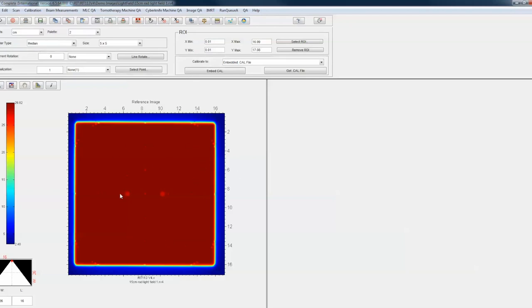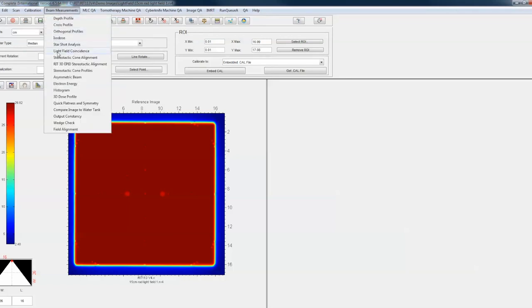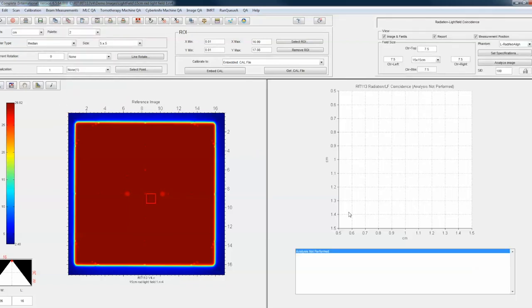This is a radiation light field that was done with an iso-align phantom. You don't really need the iso-align phantom to do this, but let's open up the light field coincidence routine. One thing the software does need is a center object — so if you had a piece of film, you might be putting a pinprick at the center at isocenter.